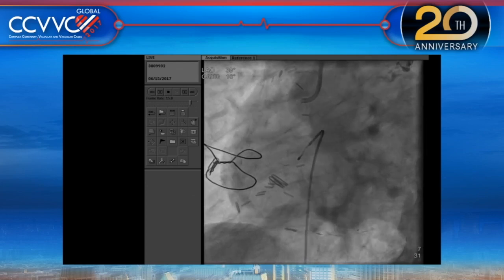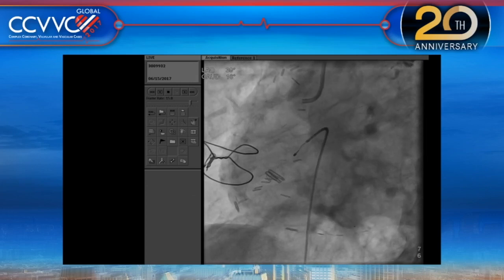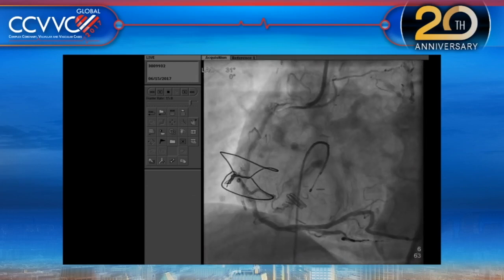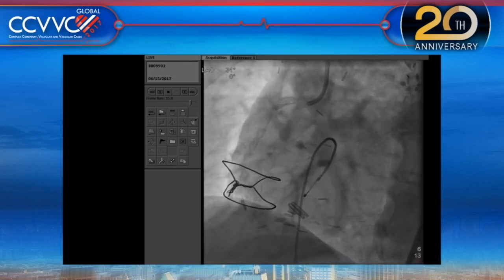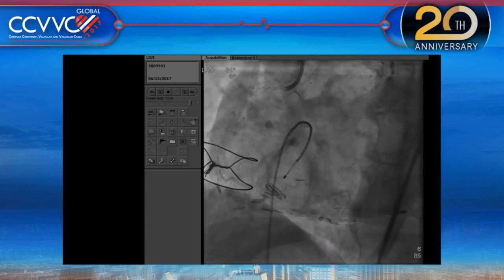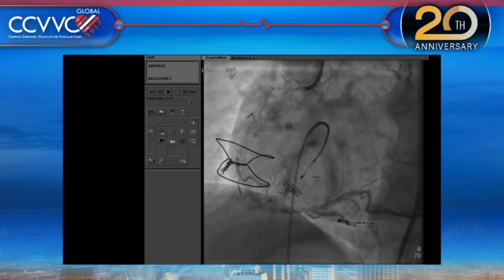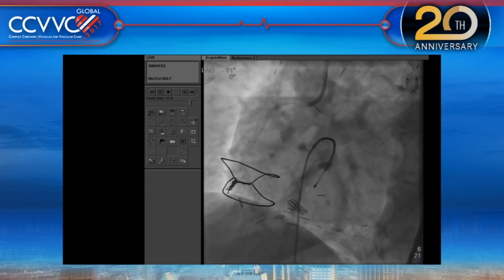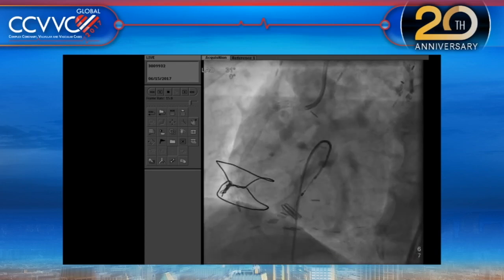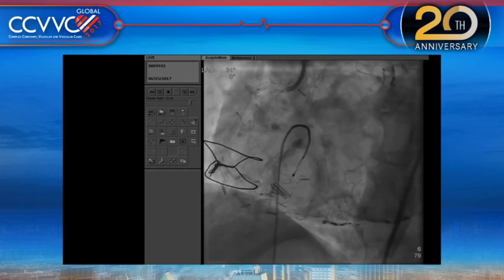Before you tell us you're going to do rotational atherectomy here, I want to hear what other people would do in a case like this. No, this calcium, we thought that maybe it could be because of an initial stent. So let's try the orbital atherectomy. This case was planned for orbital atherectomy for this calcific, angulated lesion, and from a very prominent institution in New York City it was declined. They said this is a very tough case, cannot be done. I said that definitely belongs to our June 15th symposium.